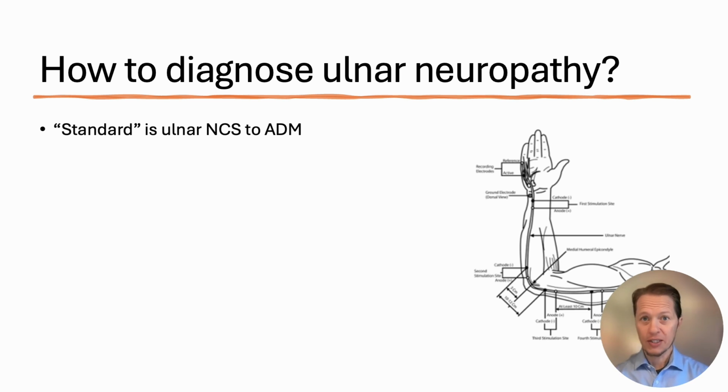So this now brings up the discussion, not really debate, of what's the best way to diagnose ulnar neuropathy, right? We all learned to do nerve conduction to ADM. That's just the way it is, like the picture shows. That's kind of how you do it.